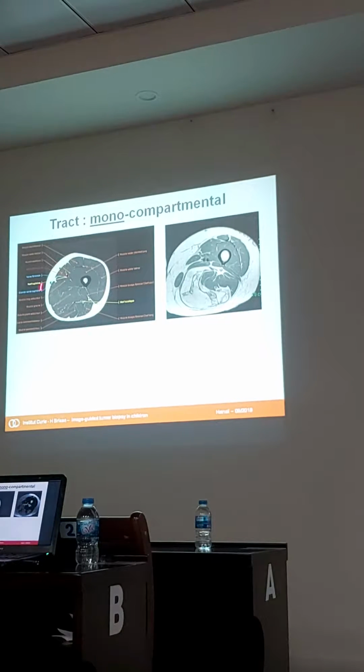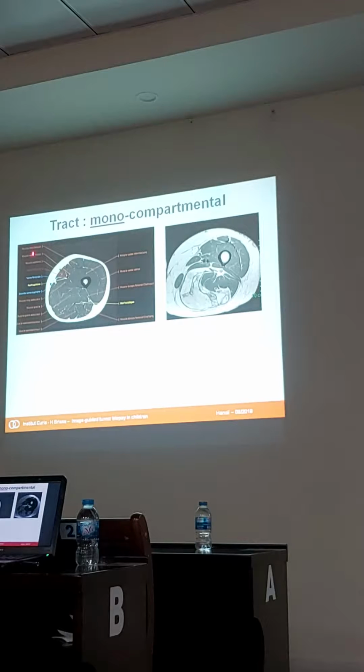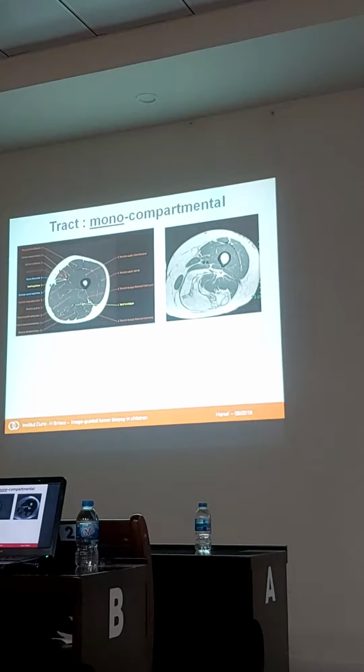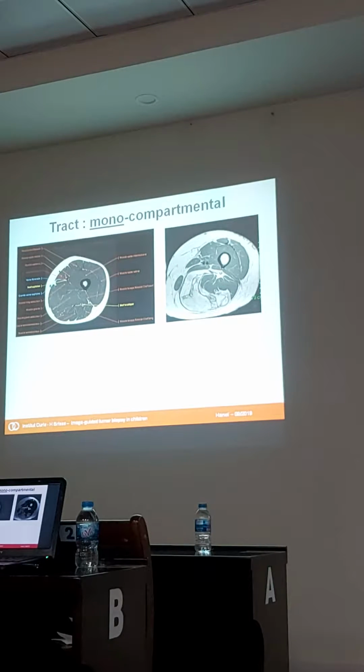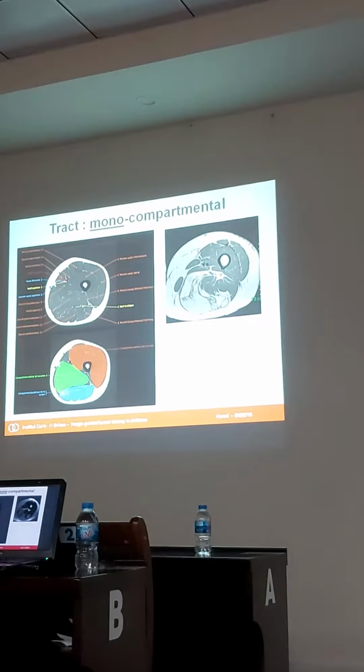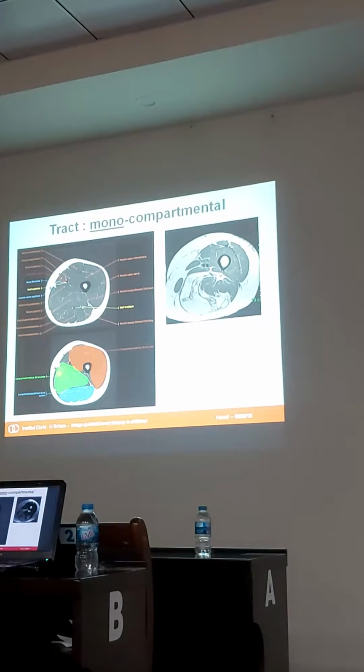So you first have to look at your anatomy, and you know where exactly the vessels and the nerve are located. Here is the sciatic nerve, which is located here. You must avoid this, of course. And here are the superficial femoral vessels. So for the way you have to biopsy, there are several options, but which one is a good one? You have to look at the compartmental anatomy. So the tumor is obviously located here in the medial compartment of the thigh. It's not located in the posterior part, which is here.